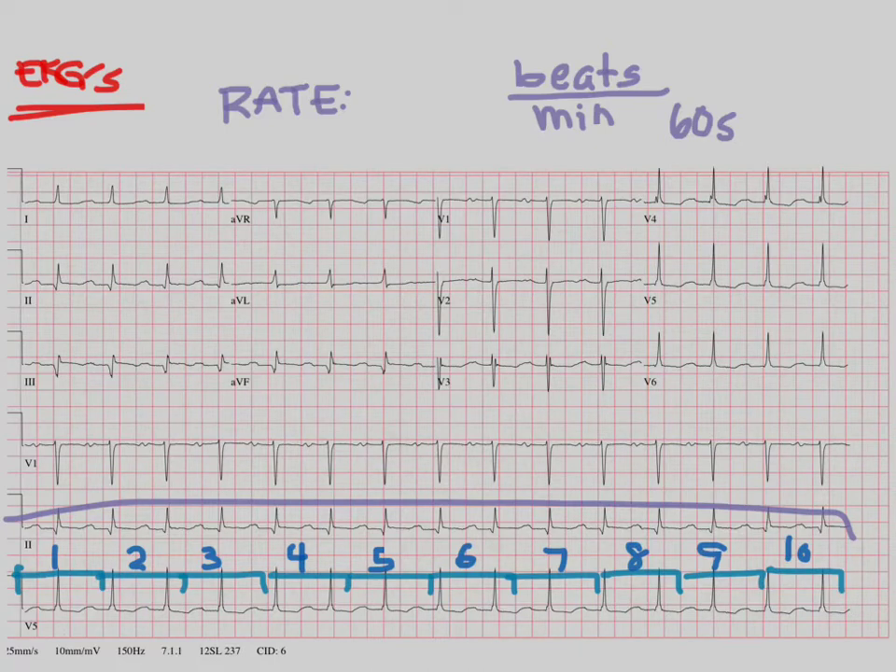So let's take it here. We've got 1, 2, 3, 4, 5, 6, 7, 8, 9, 10, 11, 12, 13, 14, 15. So the rate here would be 15 times 6, or 90. So that's one way to measure the rate.